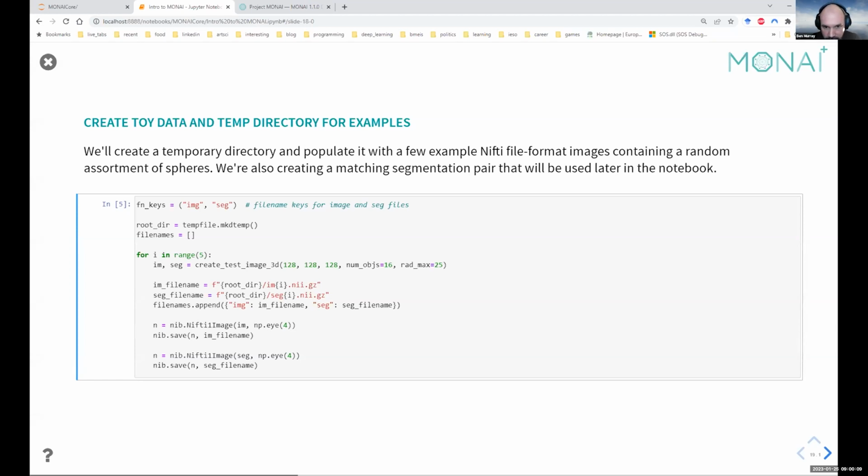What's this question here? Loading medical data generates some meta info, orientation and spacing, but most transforms only take a tensor in their input via a dictionary key. How should metadata be used? So MONAI provides an extension to a standard tensor.